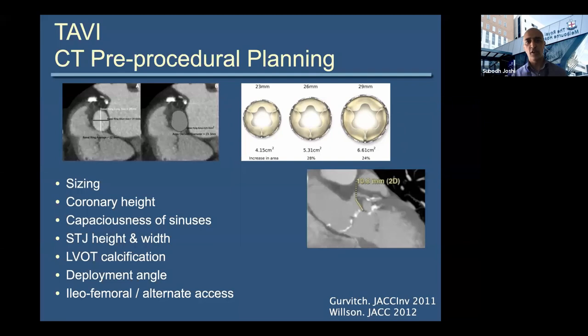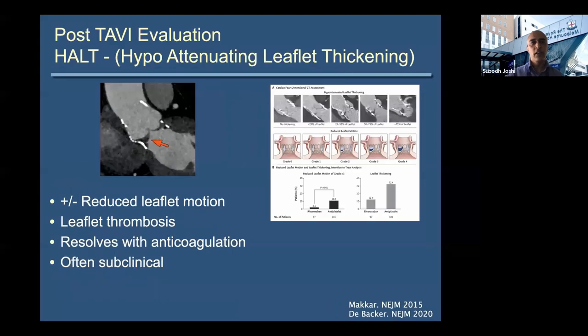And CT has been used a lot for pre-procedural planning for TAVI. In fact, everything's based on that in terms of sizing and suitability for TAVI, and you all know about this. But what we're using CT for now more and more is actually evaluation post TAVI. So for example, evaluating patients with elevated gradients across their bioprosthetic valves after TAVI.